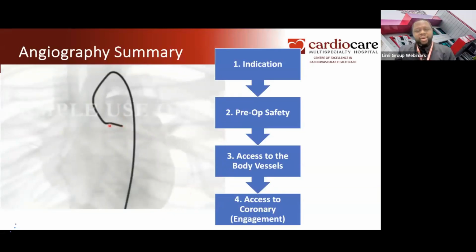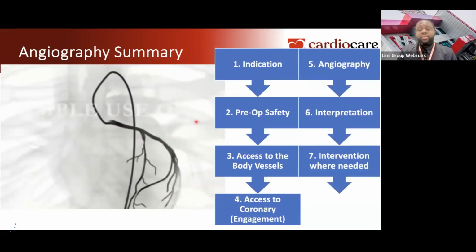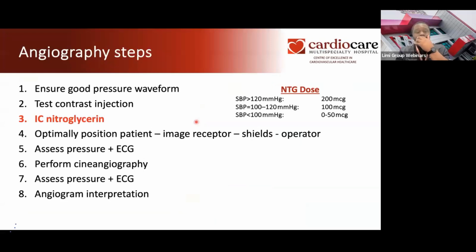Then we adjust our catheter to engage the coronary vessel which is accessed. Then we do the angiogram, which is injecting the dye, and we interpret. So I'll move a little bit faster.